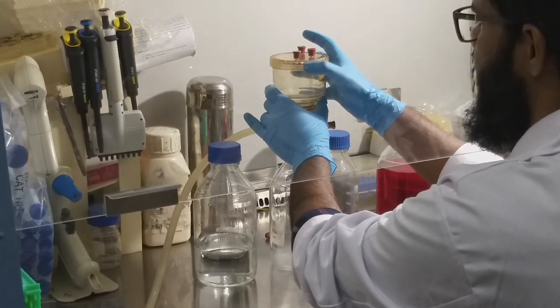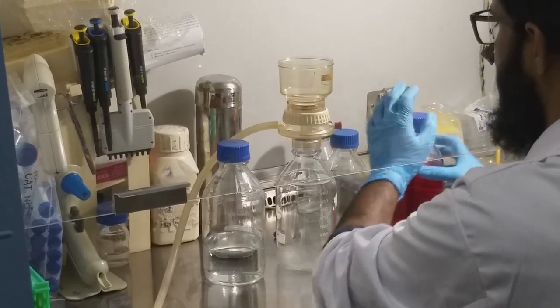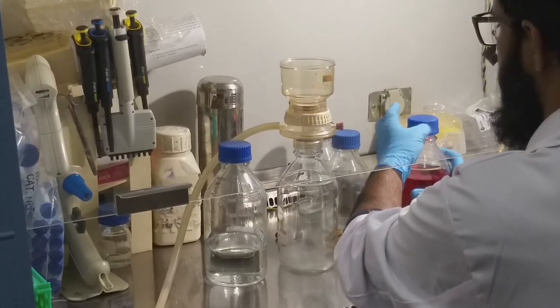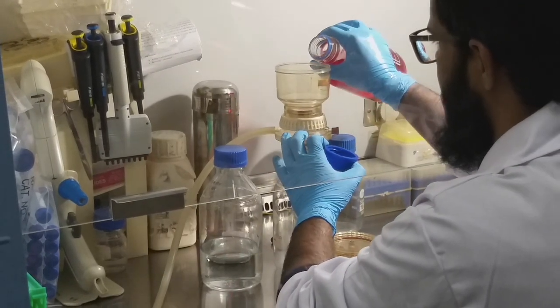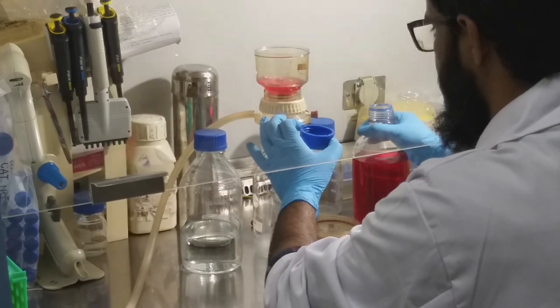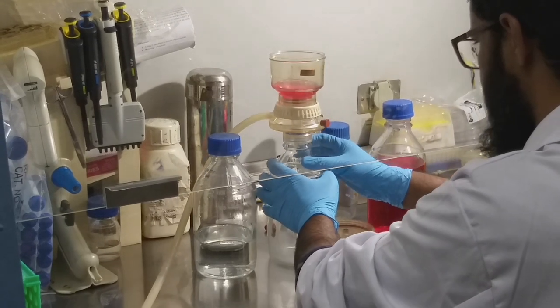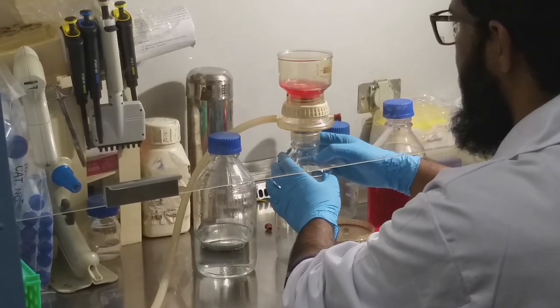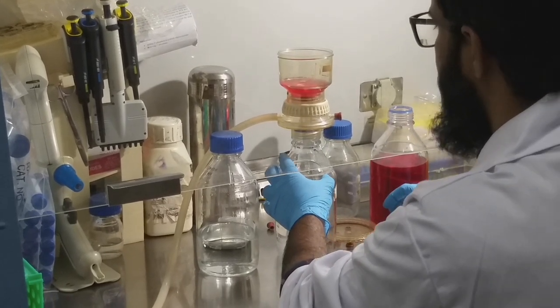Initially, we need to check the bottle top filter with less media to check whether there is any leak or not. For that purpose, we are going to add around 50 to 100 ml of media. As we can see that there is no leakage in the filter, we can proceed with the filtration.